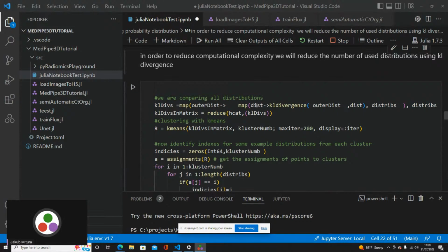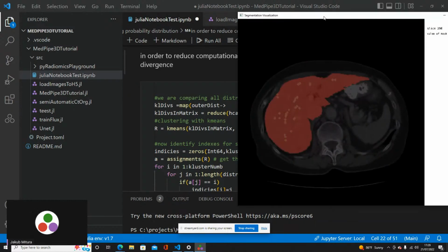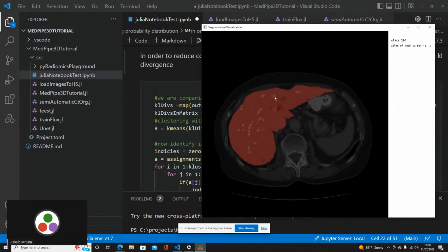So, how do we deal with the problem that it is not as fast as we would like? There are two things. One is to use different hardware and hardware techniques. The other is algorithmic. So let's start from the algorithmic perspective. One more time, just to have everybody on the same page: around these points, on the basis of the data at these points, we have created Gaussian distributions.